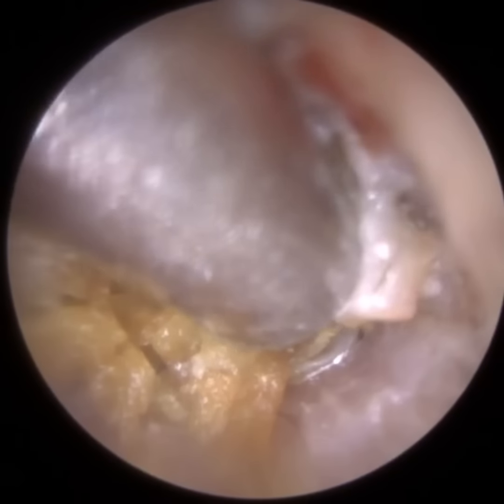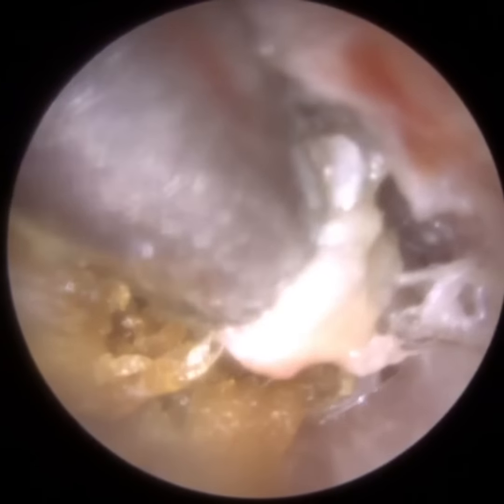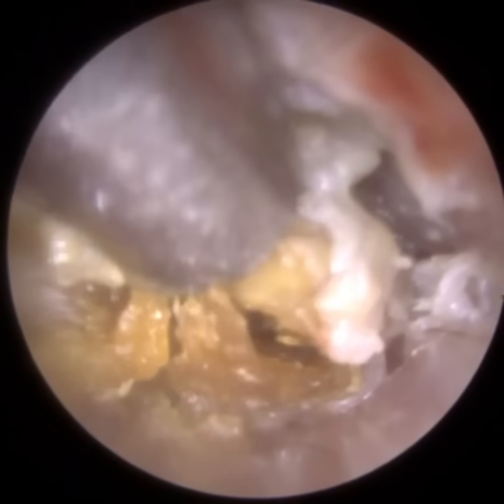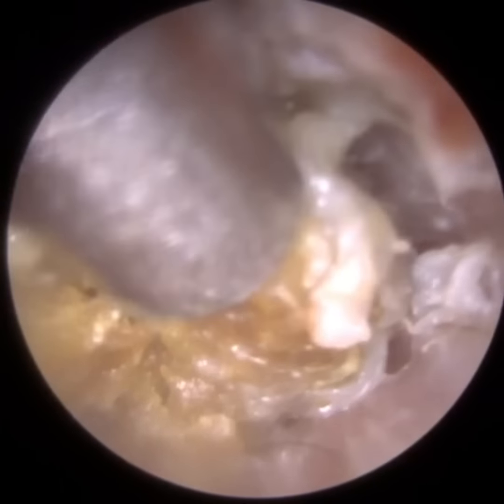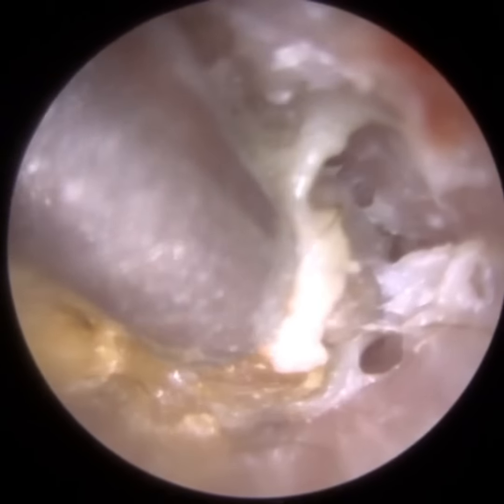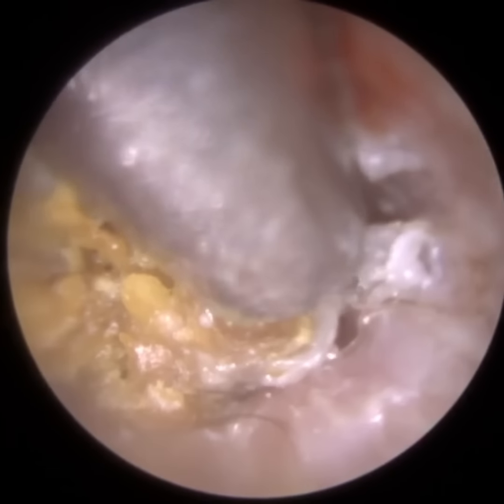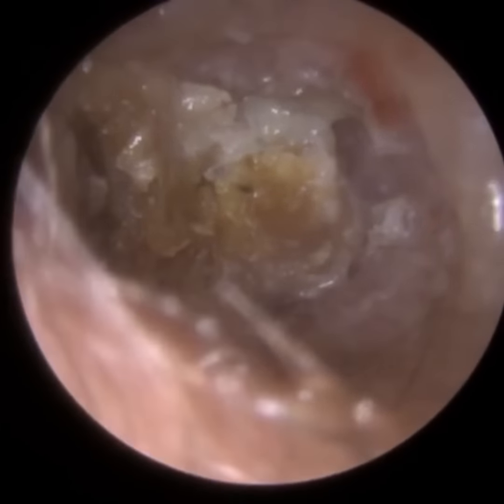Now you can see the widening caused by this keratosis obturans. So the ear canal here, it's expanded because of the plug, it's widened, it's stretched the ear canal. So it's very likely that this patient will need to have their ears cleaned on a regular basis, because when you've got a widening of the ear canal like this, it's not uncommon for skin that's shedding off the eardrum and the deeper part of the ear canal to get trapped in the widening.